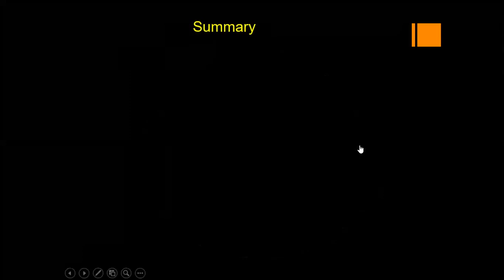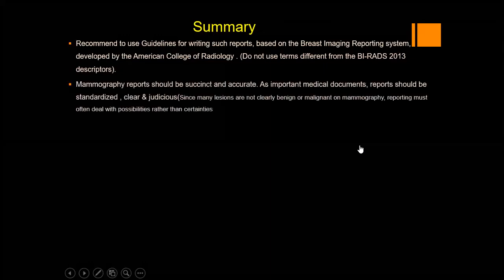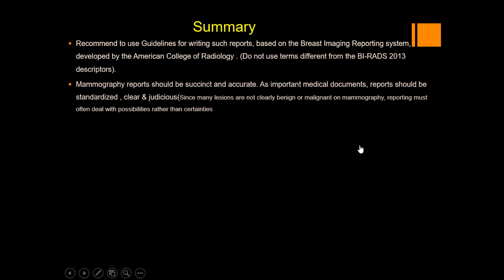So we read the summary. It is recommended to use the guidelines for writing such reports based on the breast imaging reporting system developed by the American College of Radiology. Do not use terms different from the latest edition descriptors. Use the latest edition descriptors. A mammography report should be succinct and accurate. As an important medical document, the report should be standardized, clear, and judicious.